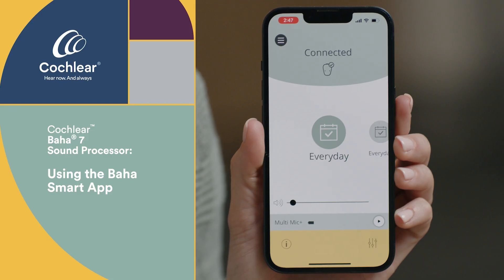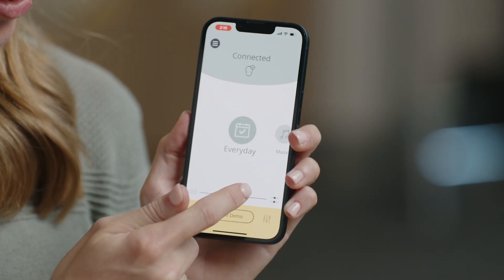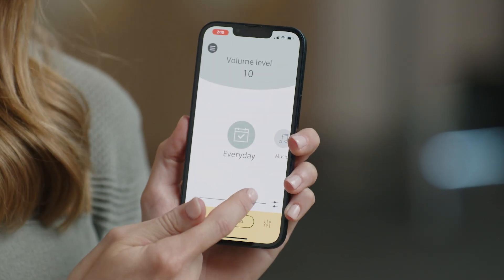If you use the free Baha Smart App, you can easily change the volume and programs of your sound processor right from your phone, anytime, anywhere. From the home screen of your Smart App, you will see a volume slider at the bottom. Slide the circle along the slider to adjust your volume louder or softer.